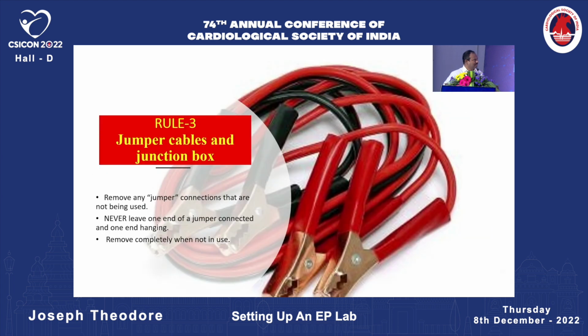Next slide. So when you use a junction box, when you use a jumper cable for unipolar signals and all those things, remove any of the jumper cables which are not being used, and never leave one end of the jumper cable connected and left hanging in your junction box. And even for electrical appliances, if you're not using an infusion pump in your EP lab, try to switch off the infusion pump so that you reduce the noise there.